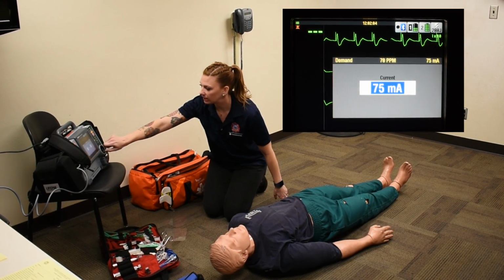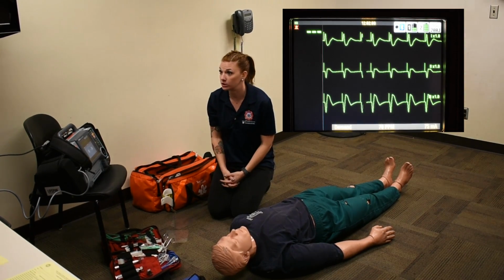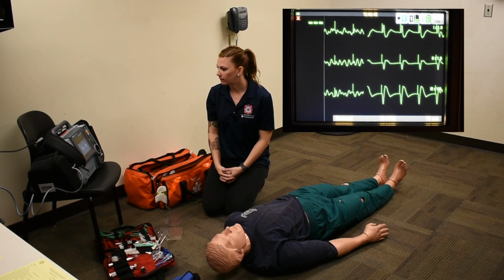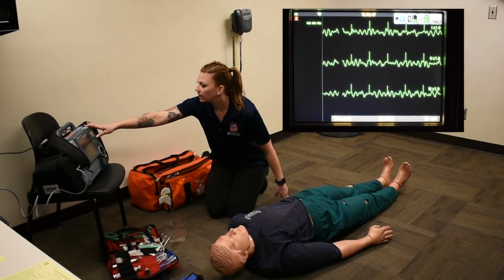I'm going to increase my milliamps just by 5 and continue to pace my patient, monitoring my patient's blood pressure and skin signs. Your patient suddenly slumps over and becomes unresponsive. Okay, does he have a pulse? No. All right, right here I see VFib on the monitor.